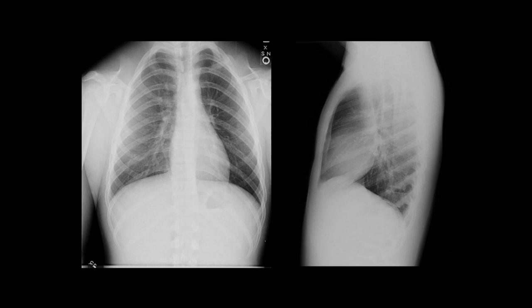Here we have AP and lateral views of the chest — another classic recognition case. This patient has absent clavicles bilaterally. When presenting this to lower-level residents they often don't get the finding because it is bilateral and the body is symmetric. If the absence were unilateral it would be easier to spot. This is a case of cleidocranial dysplasia or dysostosis.